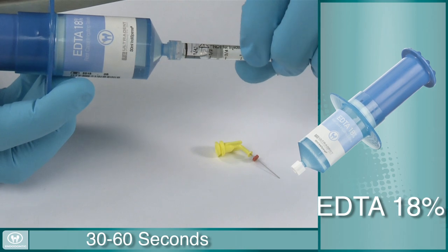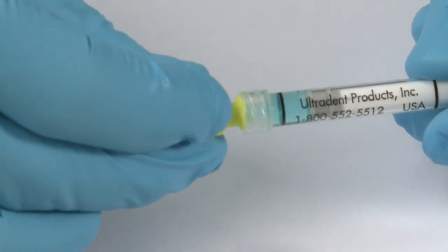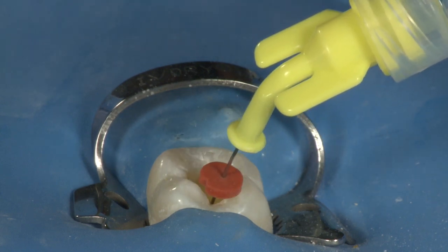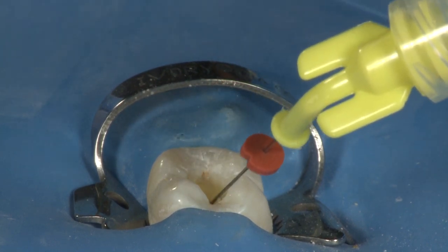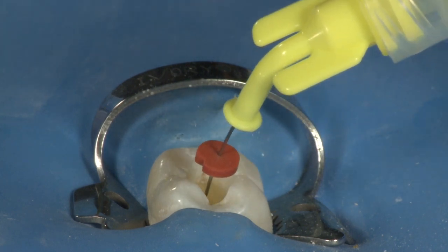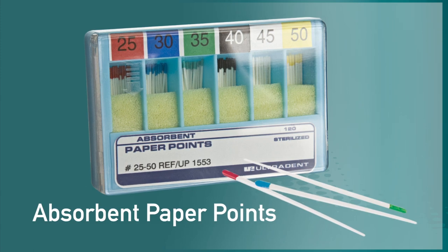Load a 1.2-milliliter syringe with liquid EDTA 18% from the Indispense syringe and attach a 30-gauge NaviTip. Load another 1.2-milliliter syringe with Consepsis, 2% chlorhexidine gluconate, and attach a 30-gauge NaviTip. Fill the canal with liquid EDTA 18% and allow it to soak for 30 to 60 seconds — where Chloracid removes organic matter, EDTA breaks down inorganic matter such as the smear layer and exposes the dentinal tubules. Evacuate, then fill the canal with Consepsis chlorhexidine gluconate and allow it to soak for five minutes. Studies have shown that a five-minute soak with chlorhexidine provides up to 10 weeks of antimicrobial protection. Evacuate one last time and blot out the canals using one to two paper points.